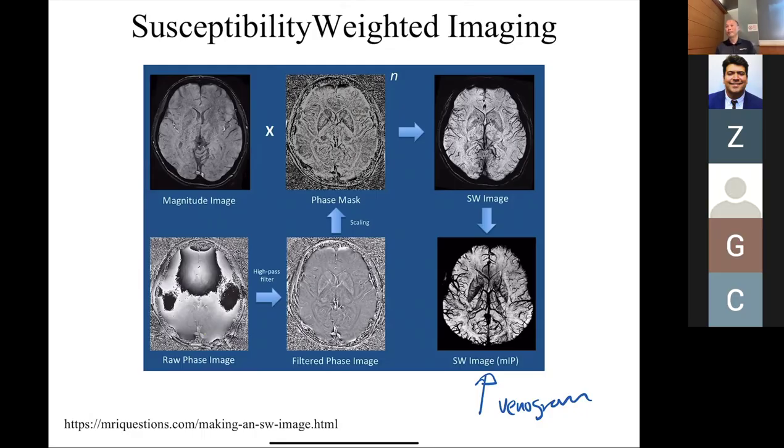Titanium is fine, yeah, because there's an MRI safe implant. Typically when you get an implant, it's usually a good idea to get the documentation and make sure it's MRI safe. Then if you ever have to have an MRI done, you actually have that documentation. Otherwise, sometimes they have to look it up. But if it's titanium, it's usually fine.